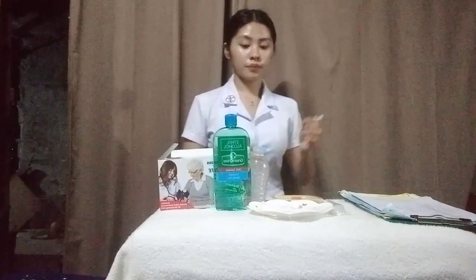And then inject the air into the vial, invert the vial, and draw medication up to the exact amount we need.